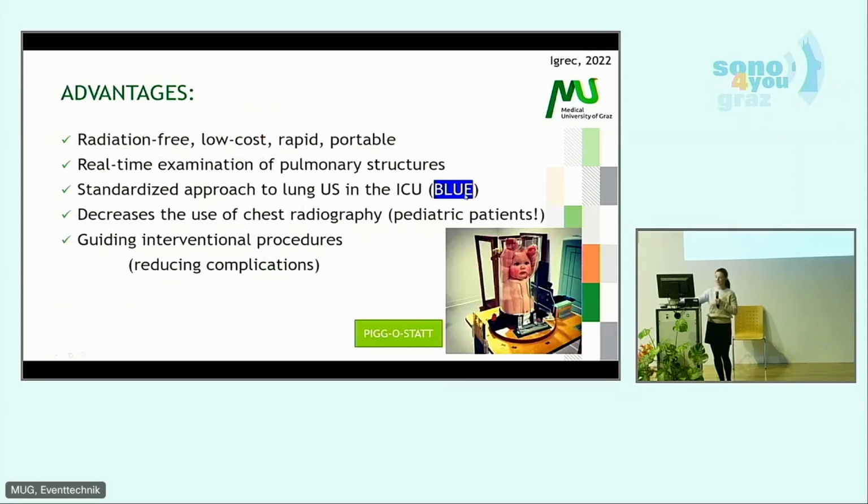Now, bedside ultrasound in emergency is standard care in intensive care units. And what is the most important for these small patients? Pediatric patients have a small diameter of the thorax, and with a proper convex transducer, we can go really deep inside the thorax, and we can also, without problem, look at the vascular structures in the mediastinum and the heart and everything else that is there.